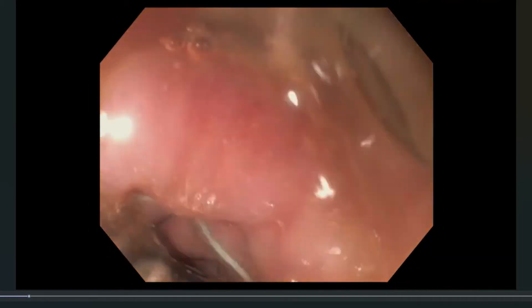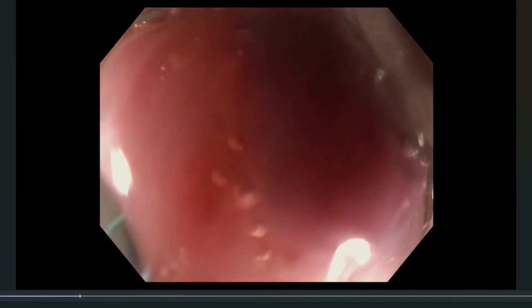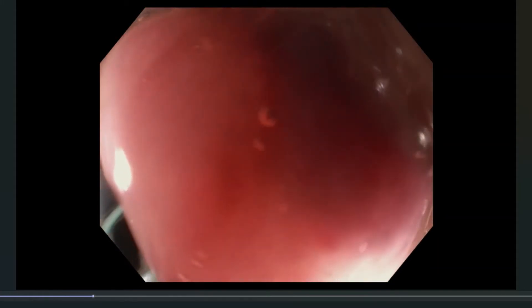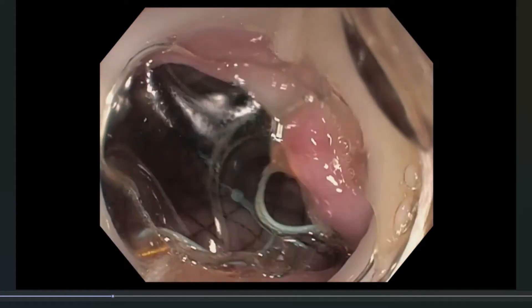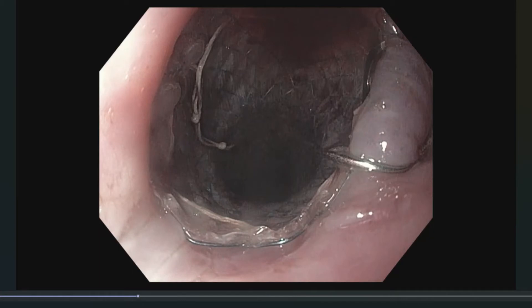Once you feel that it's adequately placed, you apply a little bit of suction, and when you see a red-out, that's when you turn the wheel — turn the dial — to deploy the clip. When properly placed, you will see a bulge of mucosa and surrounding tissue around the clip, and also the clip attached to the proximal end of the stent that you're trying to fix.